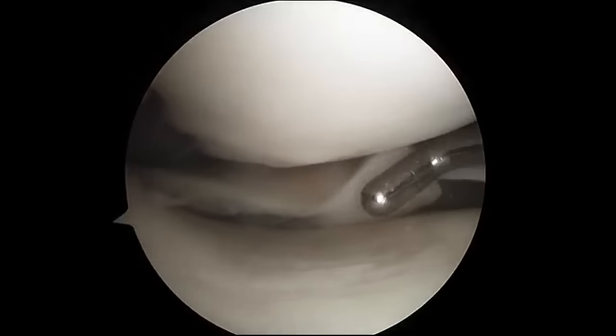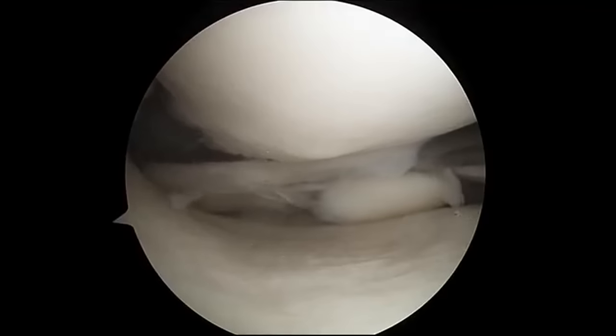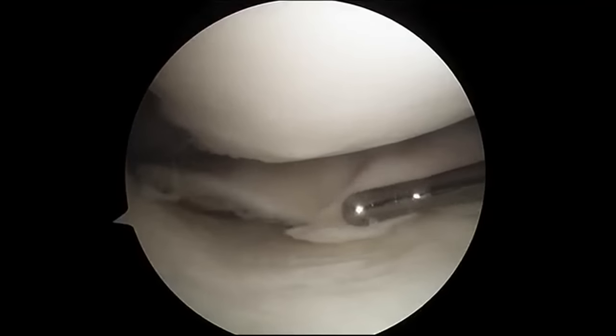This is your meniscus cushion. It's normal up here in the front. As we work our way back, there's a large flap tear of the meniscus. It's curled under right here.